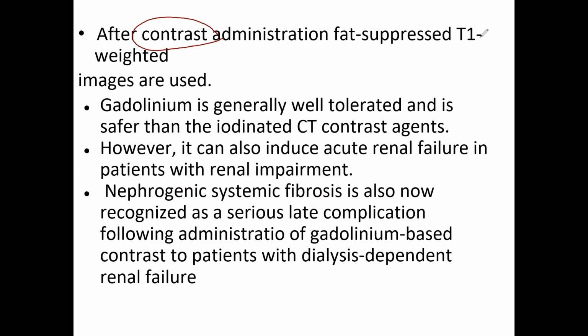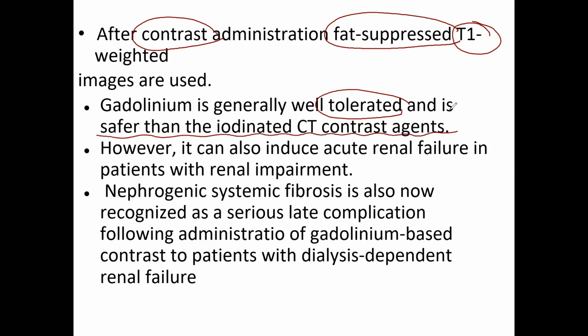So fat suppressed T1 is taken after this contrast administration. Gadolinium is well tolerated and safer than the iodinated CT contrast agents. However, it can induce acute renal failure, very importantly, with renal impairment. So better not to give it in renal impairment patients.